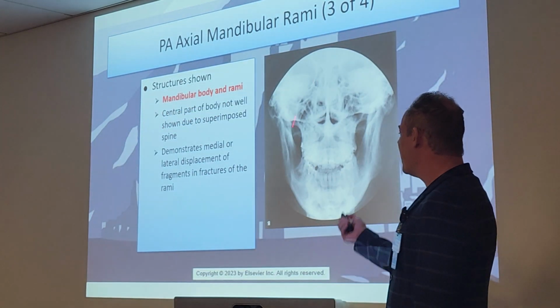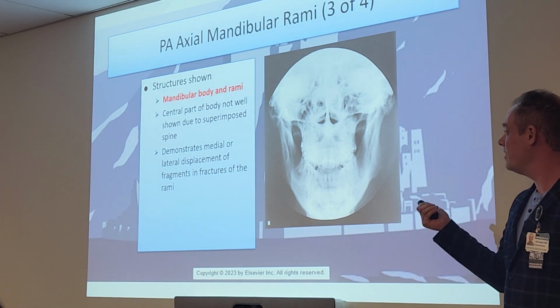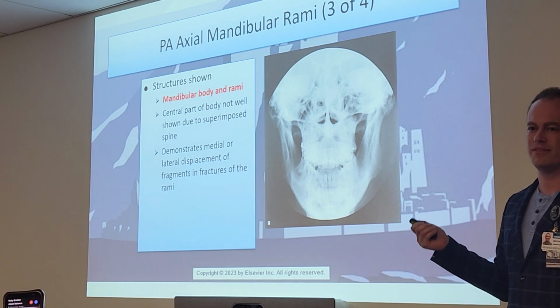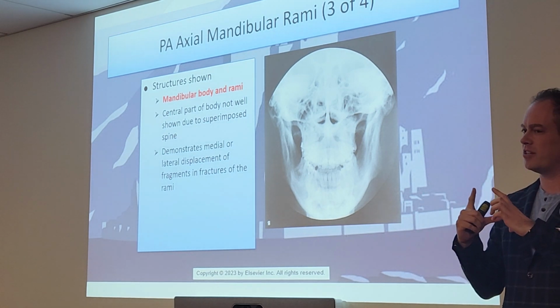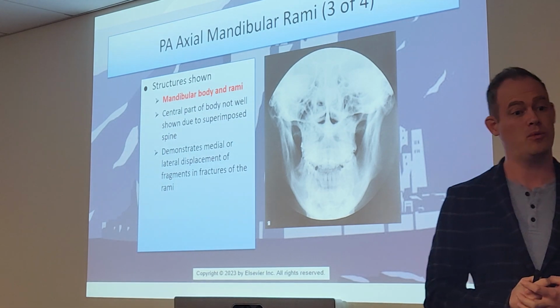All right, there you have it, guys. Just a more elongated view of that area of interest. Once again, they have a very old picture in here. You know how I know it's an old picture? It's a circle. Anytime you see a circle x-ray, that's an old film x-ray. They used to do what's called cone collimation, which was a circular collimation. We don't do that anymore. We definitely teach it, though.